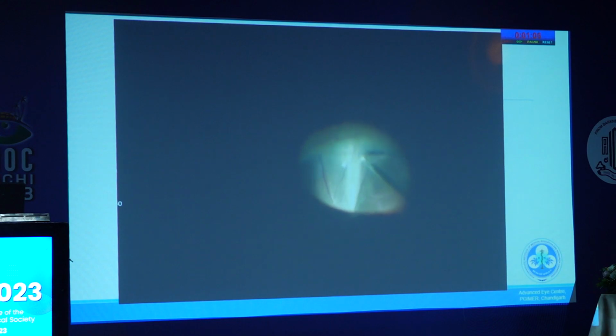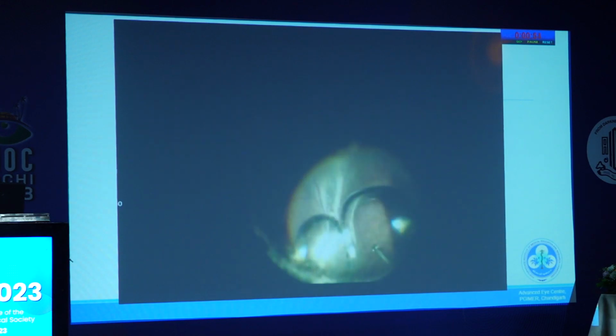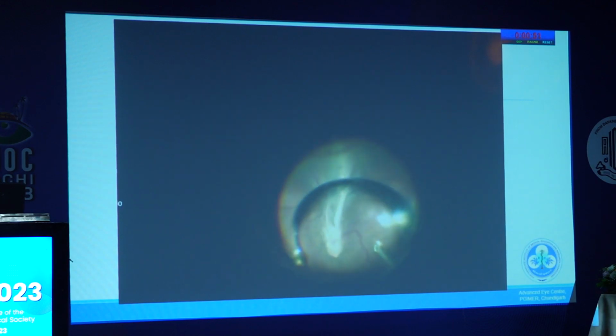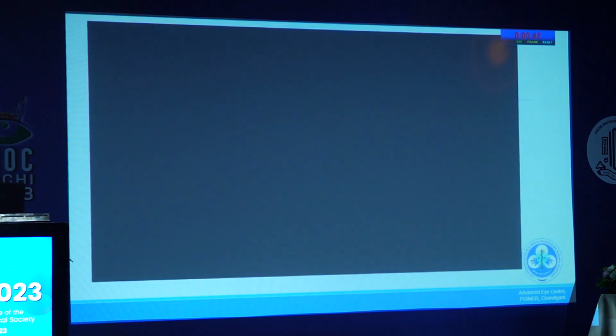So I'm using a forceps and just going up to the ridge, because beyond that it's very difficult to peel off these membranes. So I go only as far as comfortable, up to the ridge, trying not to induce any retinal break. And again, air exchange, and this is the outcome. The macula is attached and the fold has opened up. One more case.